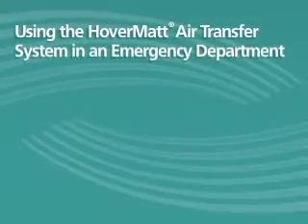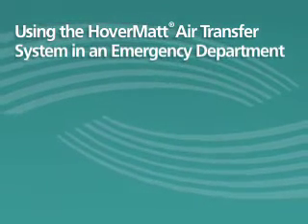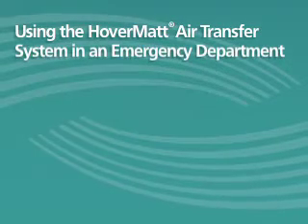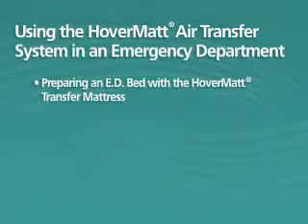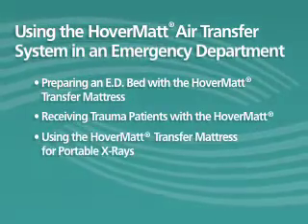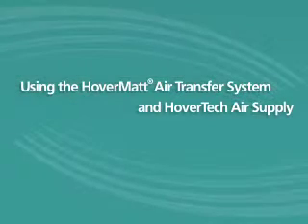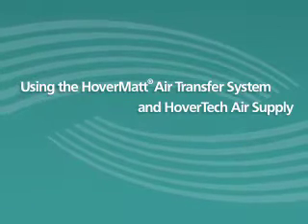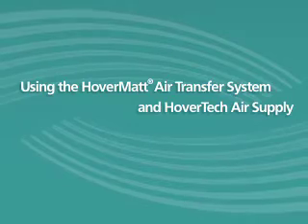In this section, we will train you on the proper use of the HoverMatt air transfer system in an emergency department. We will explain HoverTech's recommended protocol for proper HoverMatt placement on an ED stretcher, receiving trauma patients, and performing portable X-rays. This segment will show the HoverMatt in use. Please review Using the HoverMatt Air Transfer System and HoverTech Air Supply video for detailed instructions before using the HoverMatt Air Transfer System.